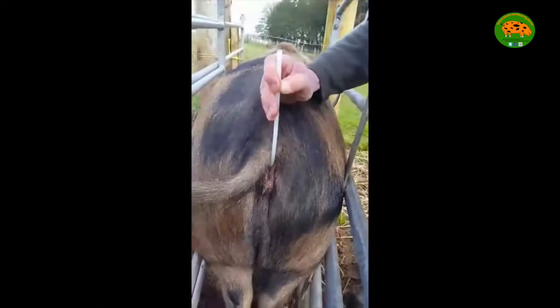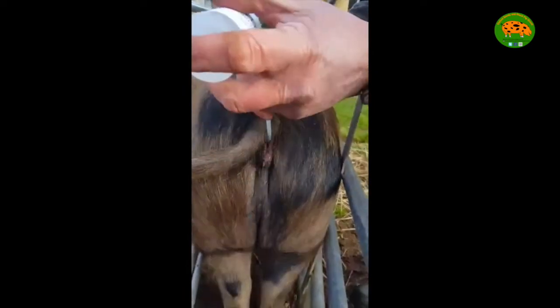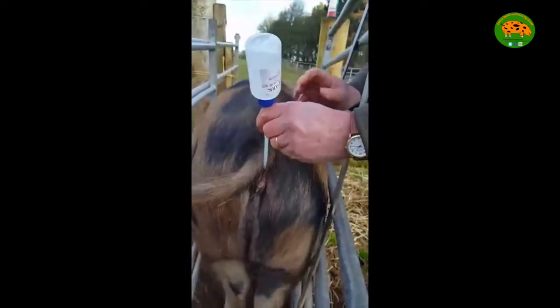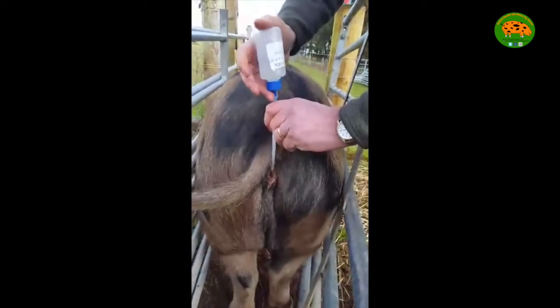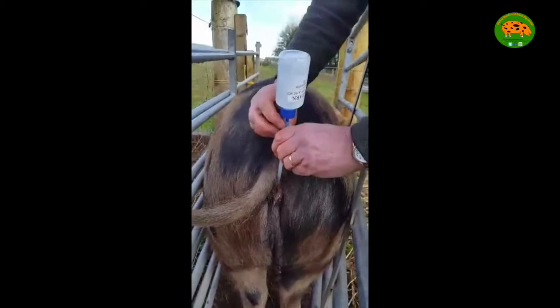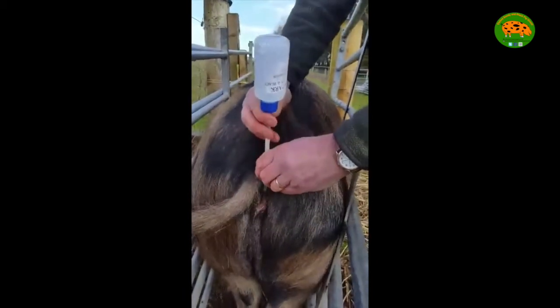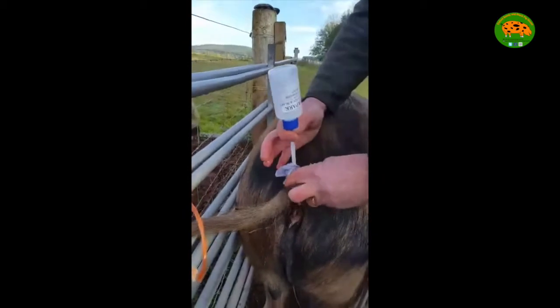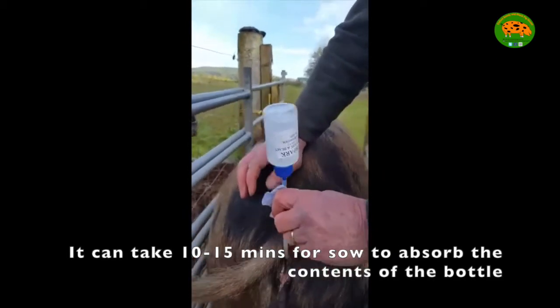This will be one of three bottles you'll get into your part, and it's simply a case of opening it up at the top, sticking it in, and hopefully letting nature do the rest. There are two schools of thought about whether you should squeeze it in or just let the sow suck it out. But you will get a vacuum occasionally, and we find it's just a case of taking the bottle off, putting some air in, and putting it back on.